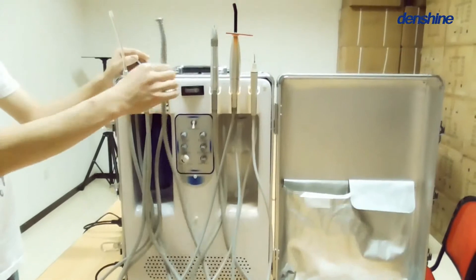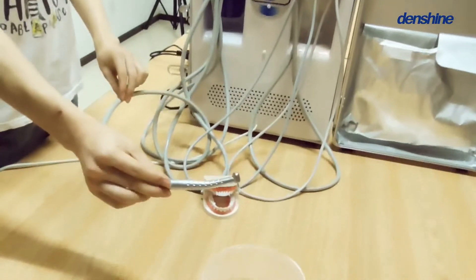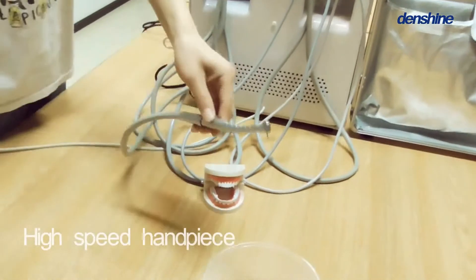Thirdly, the high-speed handpiece, which works off a foot pedal system, same as the rest of the instructions.